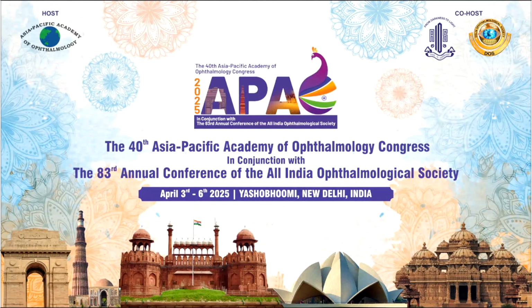it. The pupil is a structure that we have got to respect in phacosurgery. It's quite unpredictable. Any pupil dilating less than 7 millimeters, we should be suspicious. Although with any pupil above 4 millimeters, we can do phaco without using any dilators. Yes. But we have to be careful with pupils which dilate less than 6 millimeters. And in all cases, it is best to do a very low parameter phaco.